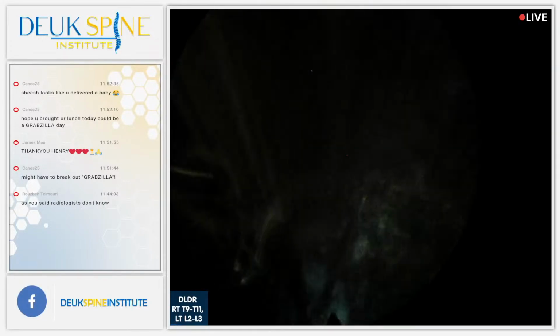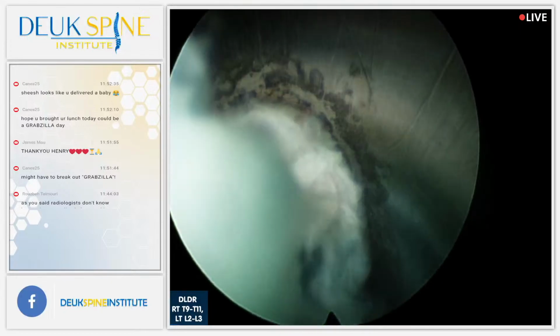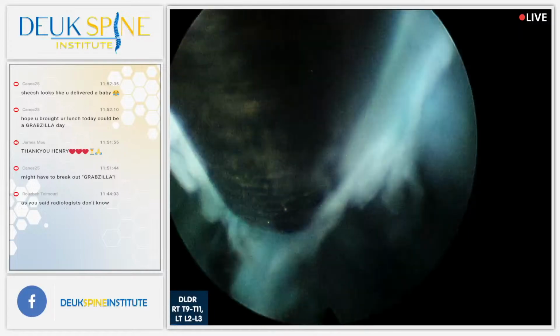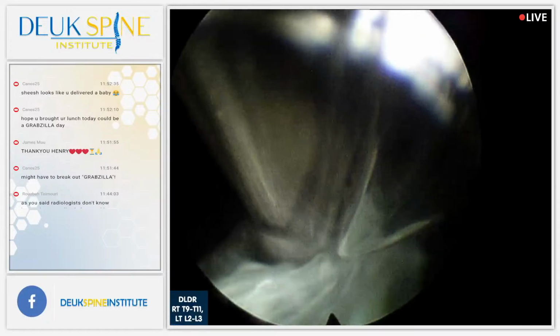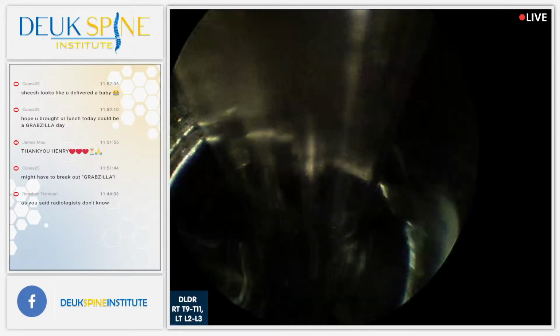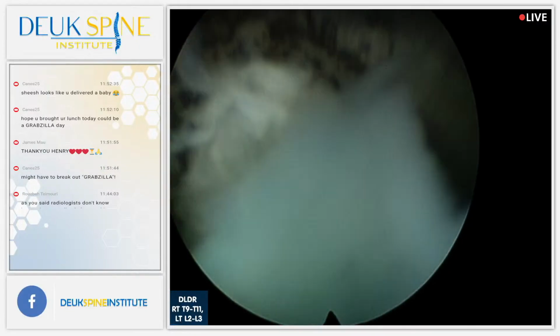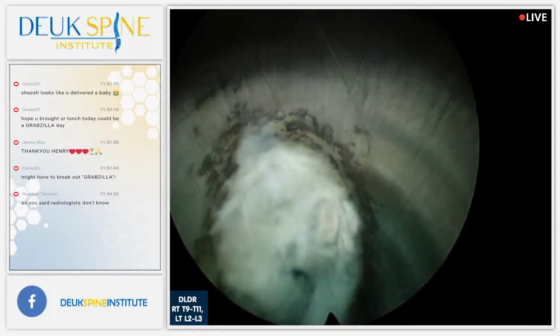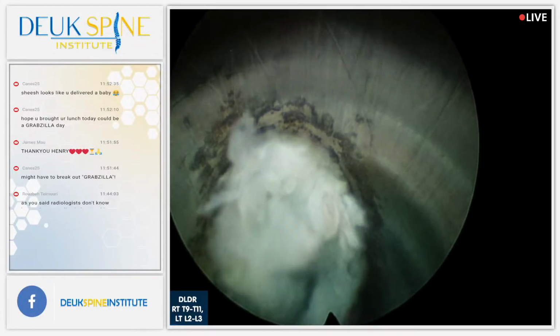You never know until you do the discogram whether or not someone's going to do well for sure. You're using the MRI, the clinical exam, x-rays, whatever, before surgery, but you never know until you do the discogram. Once you do the discogram and you see that disc is the cause of their pain, then you know for sure you're going to help them.